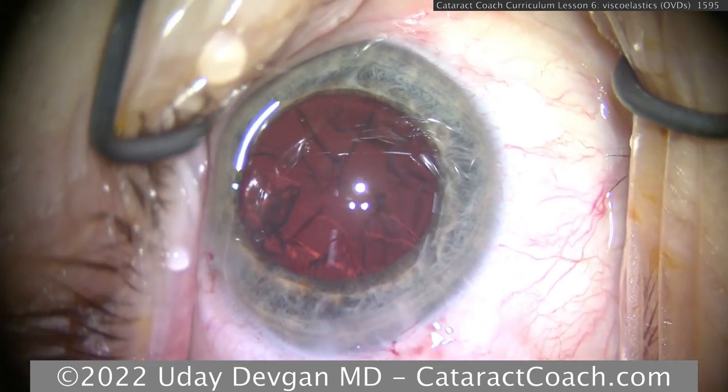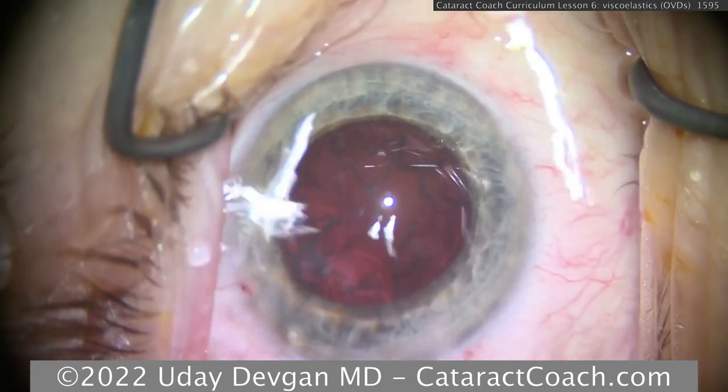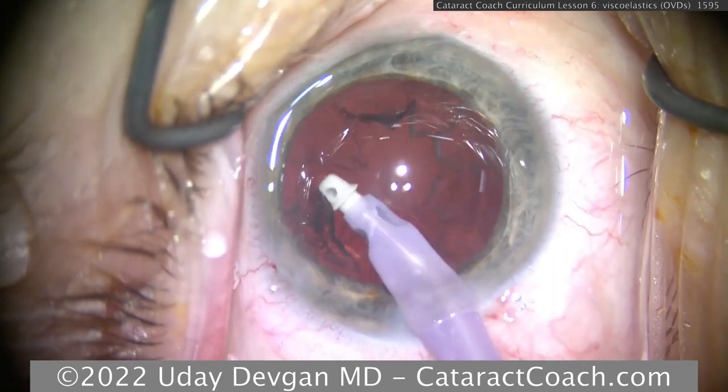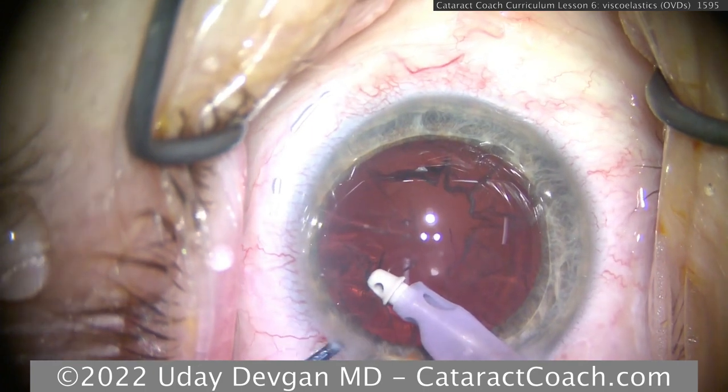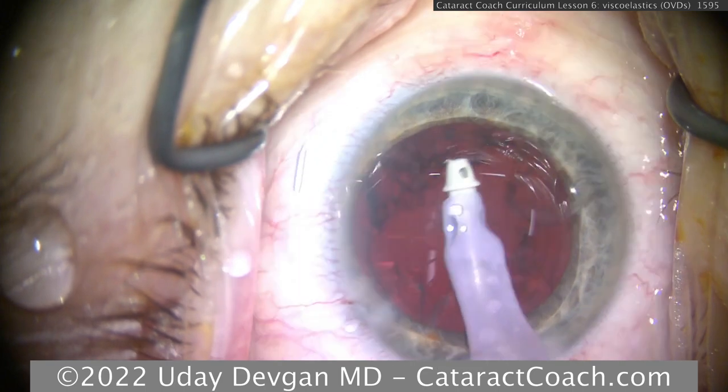Total amount of phaco energy in this case is quite low. And again, we had good viscoelastic protection. The IA probe now is going to be a higher flow setting. Remember, with a high flow setting, you're going to remove that cohesive viscoelastic, if any remains, quite quickly.